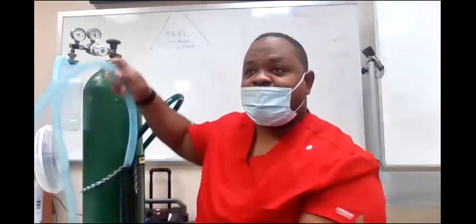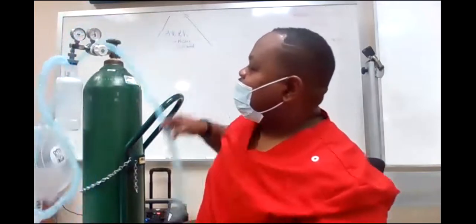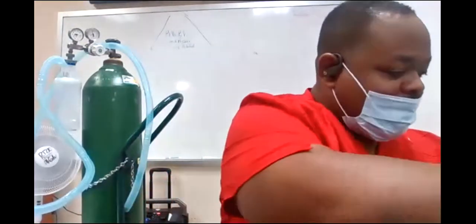There's one more to go, and that's the aerosol T-piece. Say T-piece. T-piece, like Tom. T is in Tom. Aerosol T-piece. And that is when I want it to make a T, and that's what it looks like. I have to use what's called a Briggs Adapter. Everybody say Briggs Adapter. Briggs Adapter or T-piece. That's how it makes a T. This is a T. This is really called a Briggs Adapter. So if they ask you or use that word, you need to know what they're talking about. This is a T-piece, also known as a Briggs Adapter, okay?